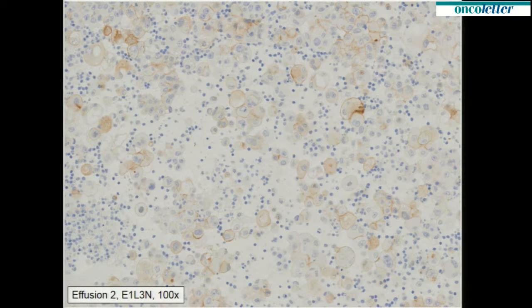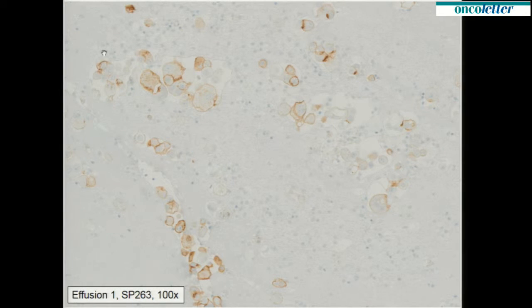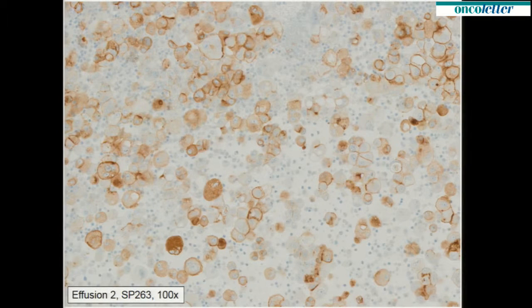Then I said, okay, we had two cytology samples, so we go for the other one, and it presents the same. And then you heard the discussions about the best antibody, so we go for Ventana, the proposed best antibody, SP263, which, as you can see here on the tonsil, is definitely already stronger on the crypt epithelia. And now we stain again the very same cell blocks, effusion 1 and effusion 2.